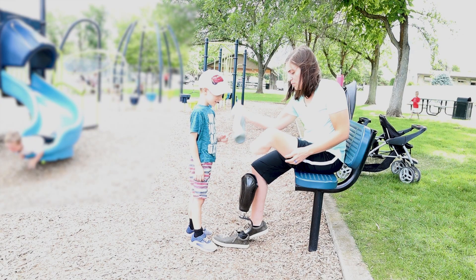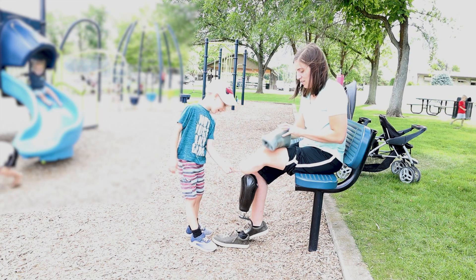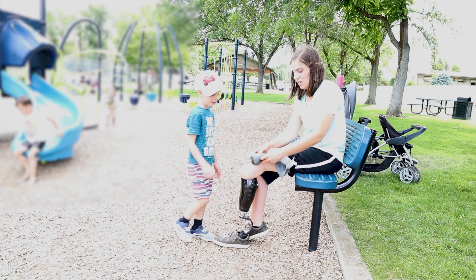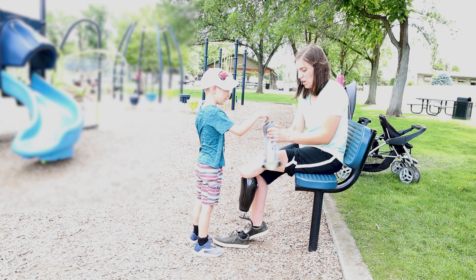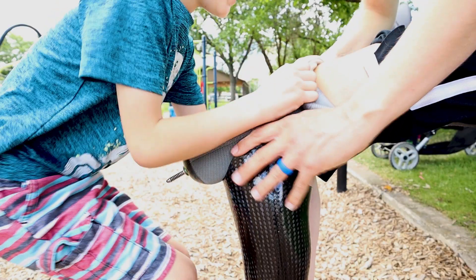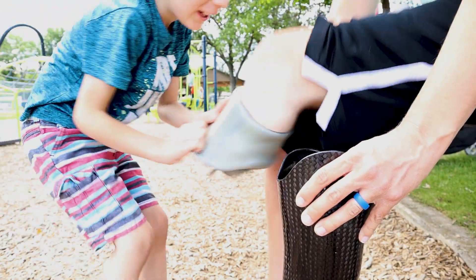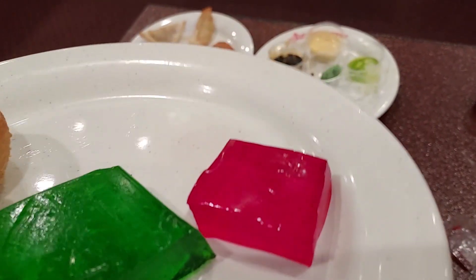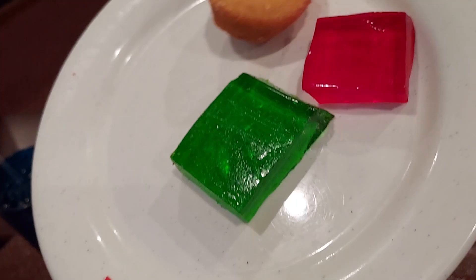Since I'm more into stand-up routines than terrifying small children, if they seem curious, I simply take off my liner. The pin is attached to this sock-like tube, not to me. The tube is called a liner and it's really grippy, so it clings to my leg, kind of like if you put jello on a plate. See how it sticks even though it's not exactly sticky?